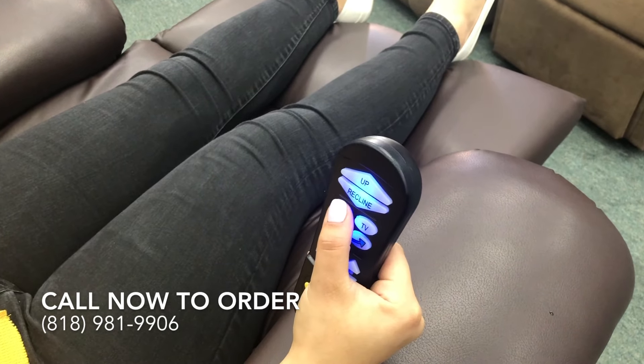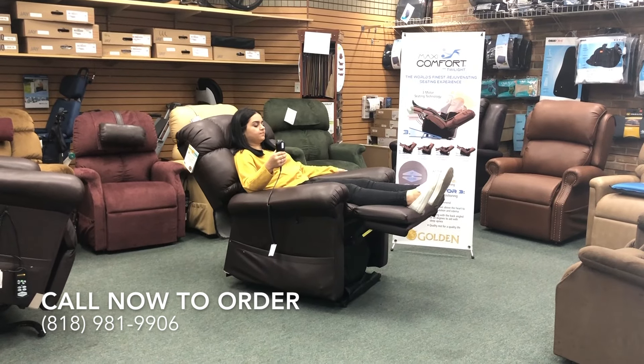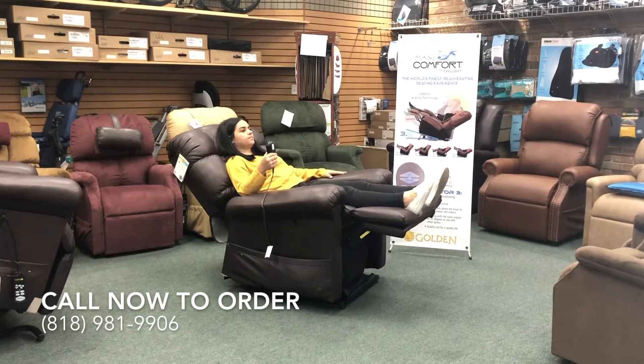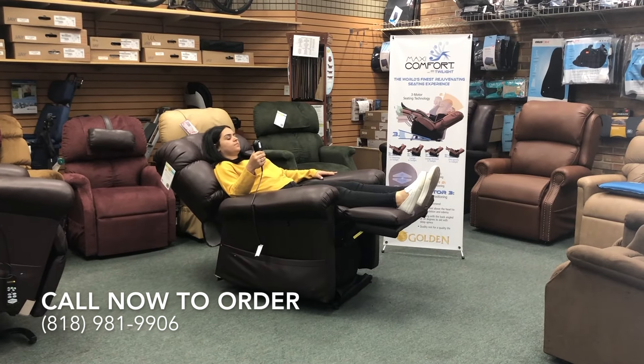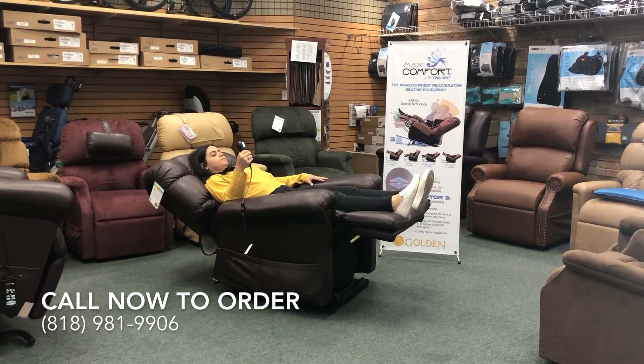Now we will enter the complete zero gravity experience by pressing the ZG button on your remote. This position offers optimum comfort and allows users to stay in their chair 12 to 24 hours at a time.